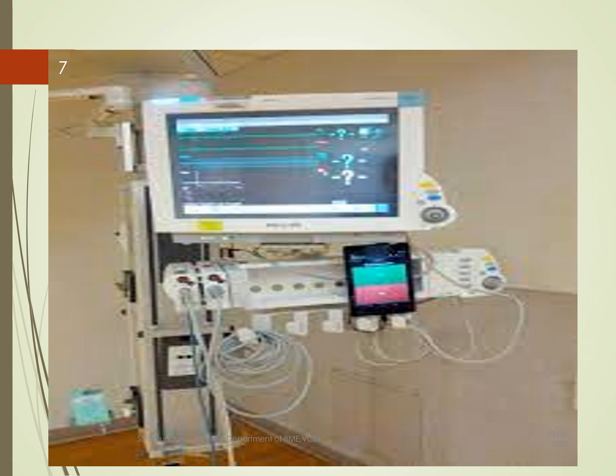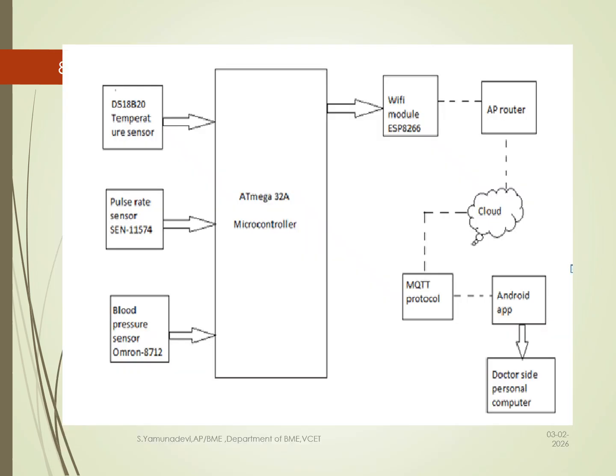And this is one type of recently used bedside monitor along with cloud storage. The doctors can see the patient's data from their tab anywhere. It is a block diagram of a recently used bedside monitor. It has a microcontroller that controls the sensor data from blood pressure, pulse rate and temperature sensors, and it is sent to a router via a Wi-Fi ESP module, and it is stored in a cloud depending upon the patient ID.